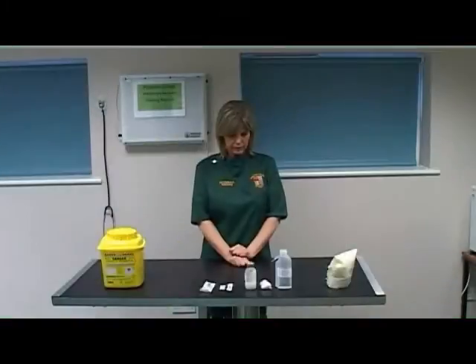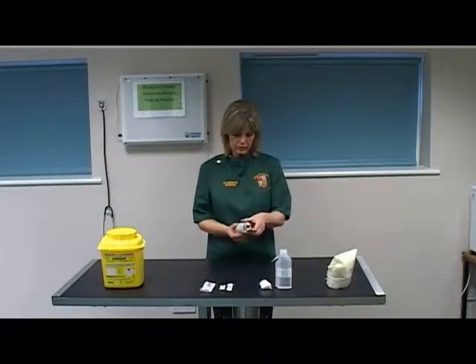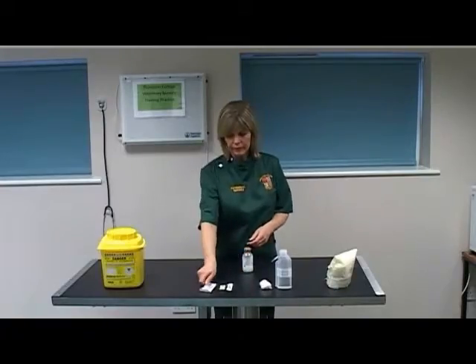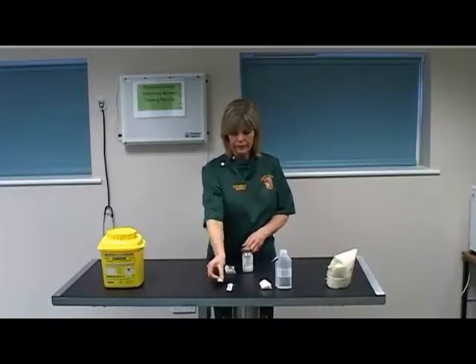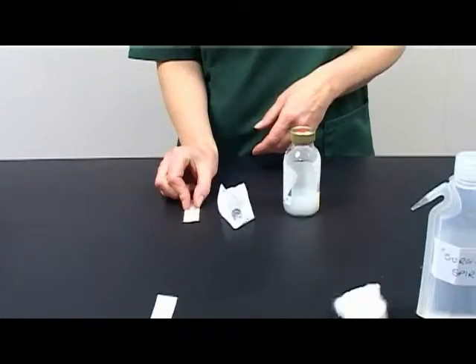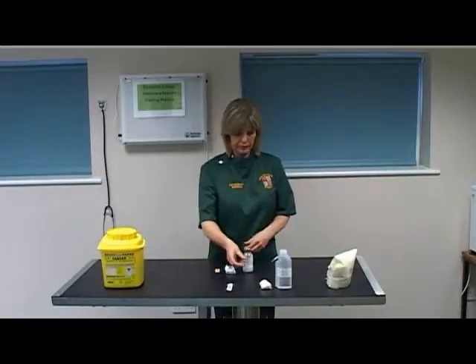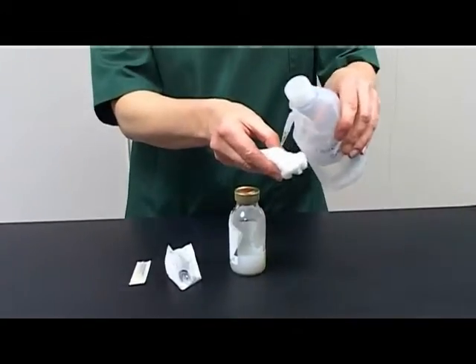Select the correct Clomoxyl vial. Check the expiry date and date of first opening. Select an appropriate syringe — 2 to 5 ml depending on dose. Select an appropriate gauge needle; for this drug, a 21 gauge or 20 gauge is appropriate. Select spirit and cotton wool.